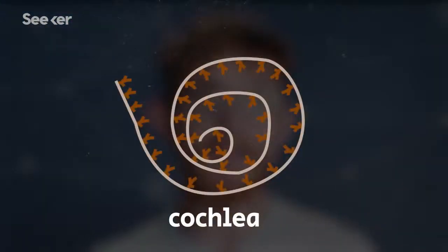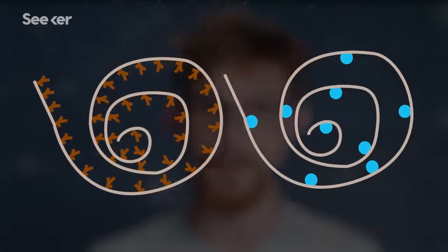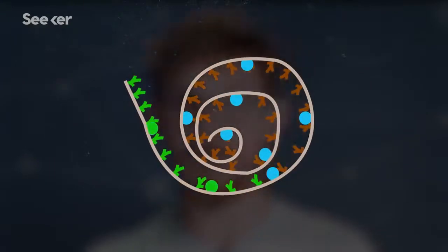It's not a perfect replica of speech, and it's not the same as having a full range of hearing. The cochlea has thousands of hair cells, while a cochlear implant only has a couple dozen electrodes, and they can activate overlapping regions of neurons, so the tones of speech and music get blurred together. Programs that help the speech processor to encode tone and timbre can aid music recognition, and by mapping an individual's cochlea, scientists can improve speech recognition by actually turning off certain electrodes that were activating unintended neurons.